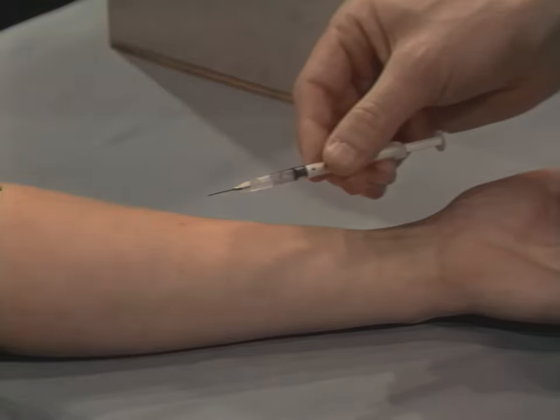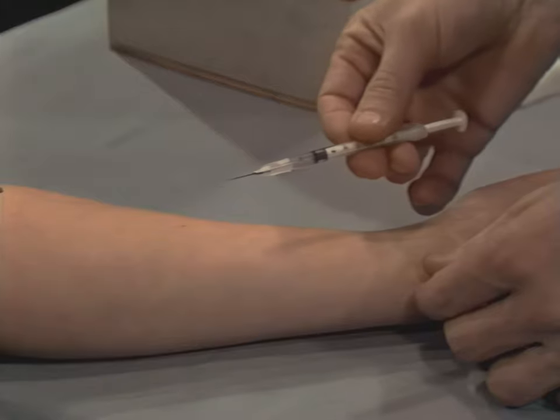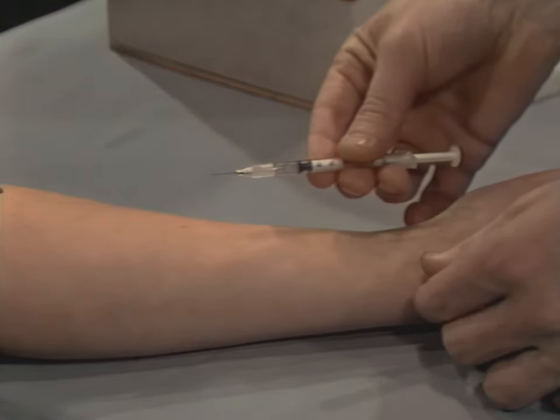Now pick up your syringe. Remove the needle guard and hold the syringe around the barrel. The bevel or cutting edge of the needle should be facing up.